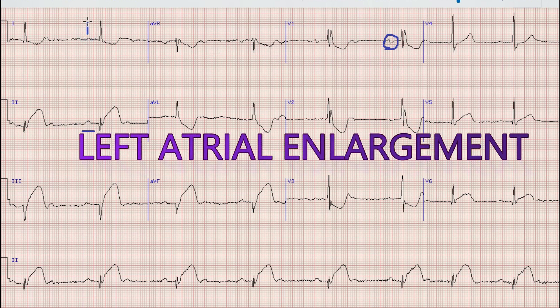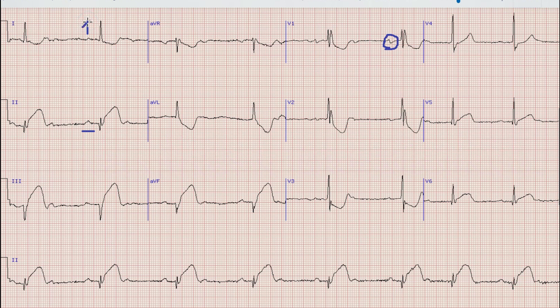After that we look at the axis. We will look at lead 1 and aVF. The QRS direction in lead 1 is upwards while it is downwards in lead aVF. So the axis in this case is left axis deviation.